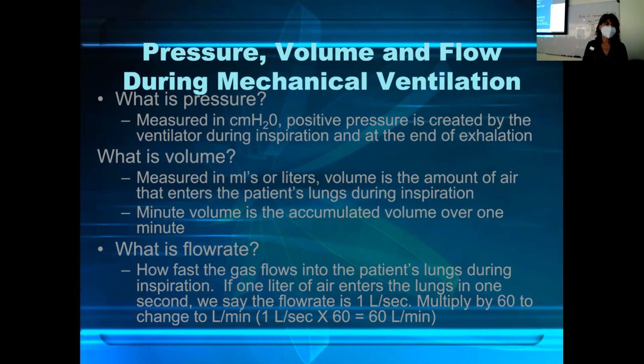The next thing we measure is volume. Volume is measured in mLs or liters. It's the amount of air that enters the patient's lungs during inspiration. I've been talking about tidal volume last week, this week. I think you're getting the gist of that. The amount of air that goes into the lungs and comes back out, that's tidal volume.